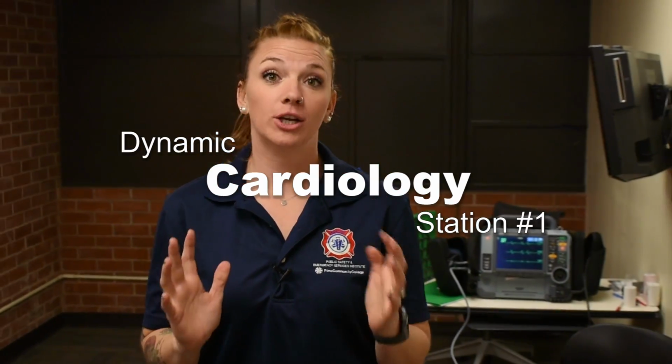Welcome to Dynamic Cardiology Station number 1. This one we chose because it's pretty straightforward, but also involves a few of the things that you need to know how to do. Some of the things you want to make sure is, again, getting your patient on the monitor, 3-lead, 12-lead, or pads within 30 seconds of starting the station.